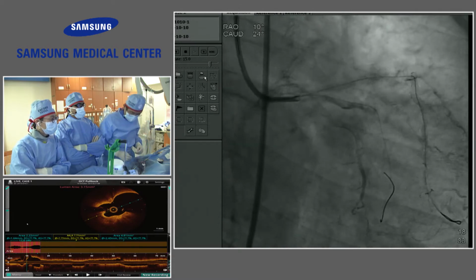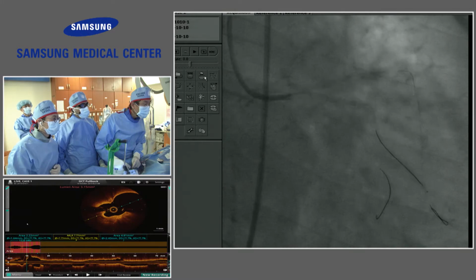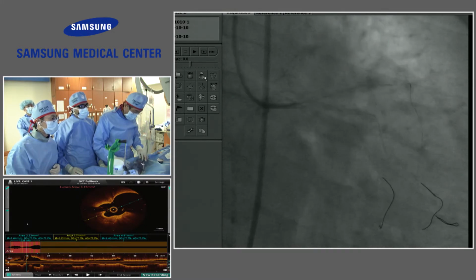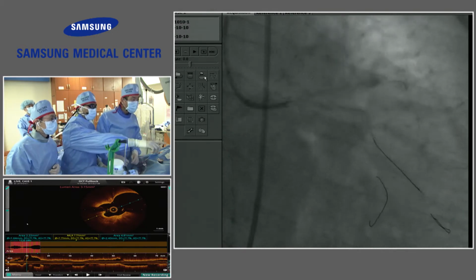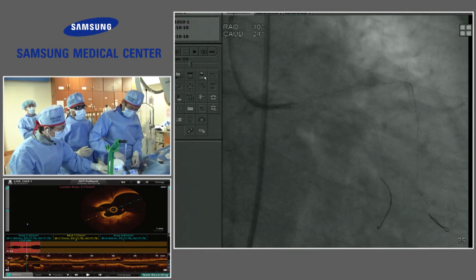I inserted the microcatheter, which was in the lumen. So we actually removed it and took a tip injection here. Oh, really? Yeah. Okay. Because I think we might be in the true lumen distally. So can we go ahead and show us the last angiogram, please?